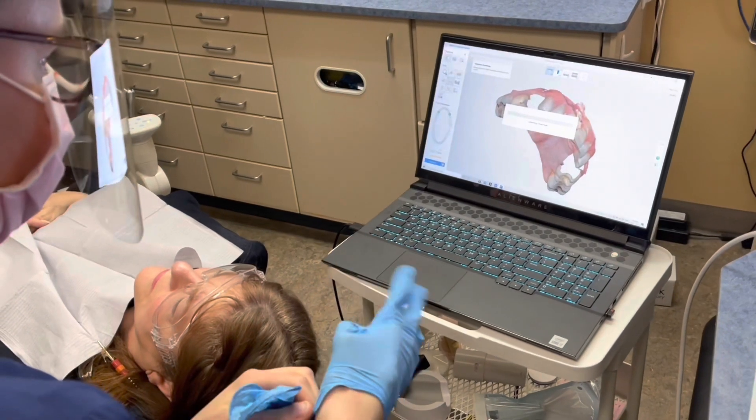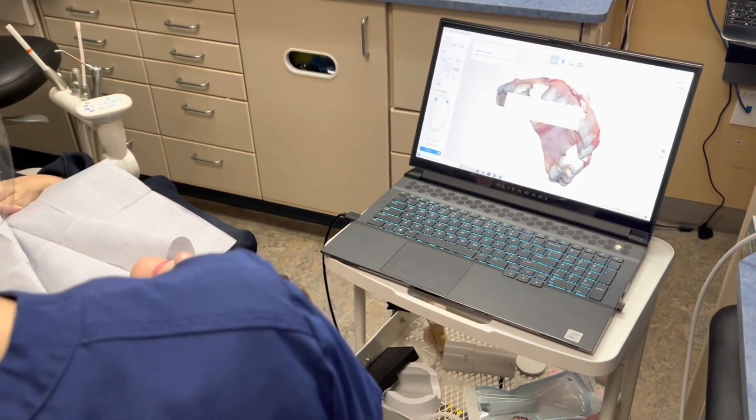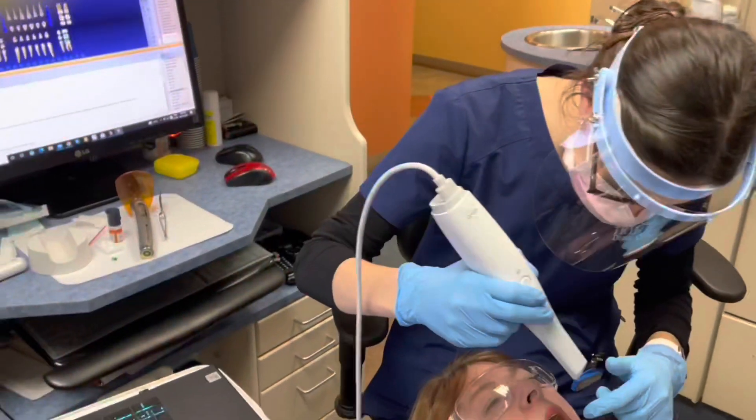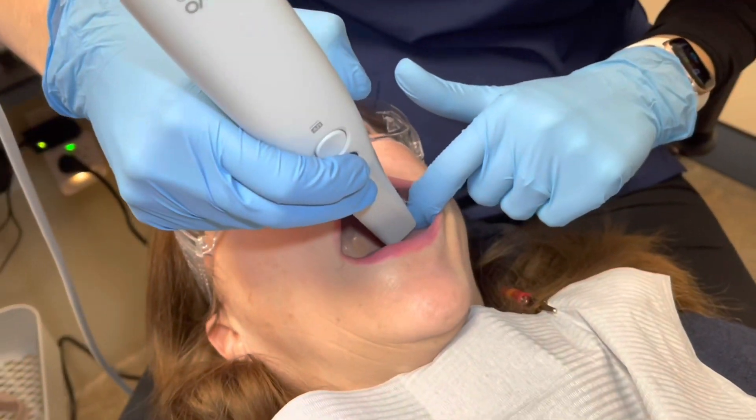The crowns are tightened down. So now we're just going to have to scan those and send that off to our Sprint Ray printer. It really doesn't take very long for the scanning to occur because we don't have to do the whole arch again.